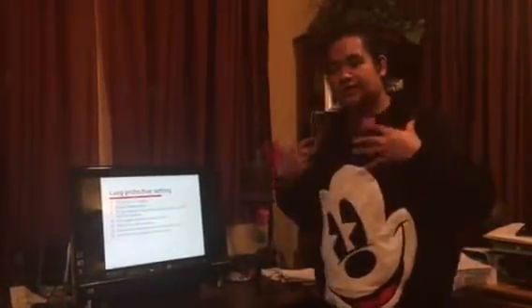Respiratory rate will be higher. Now, why do we put a higher respiratory rate for these patients? We put a higher respiratory rate for these patients because we are giving a lower than normal tidal volume. So we give them a higher respiratory rate to compensate for that volume loss.